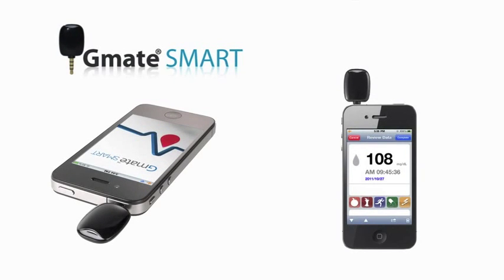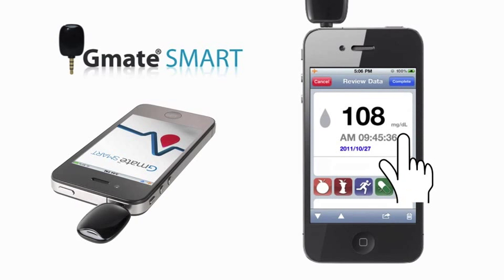Remove the test strip and touch the Save button to store the test result. The test results measured by the G-Mate Smart System are stored in the smartphone. You can review your test results whether or not your G-Mate Smart Meter is connected to the smartphone.